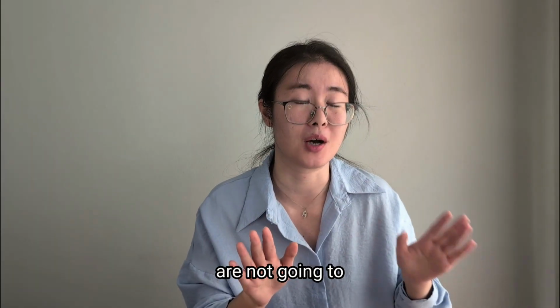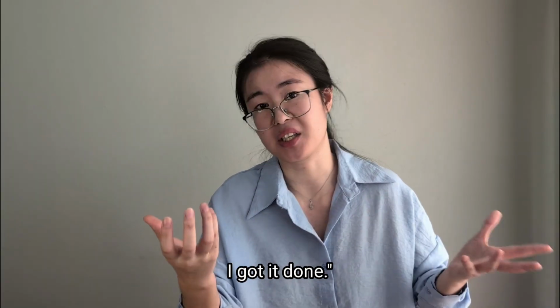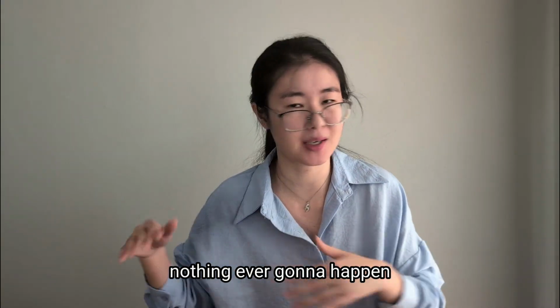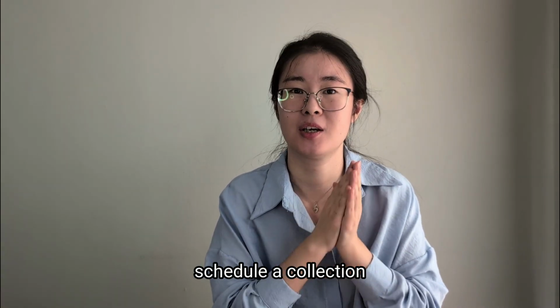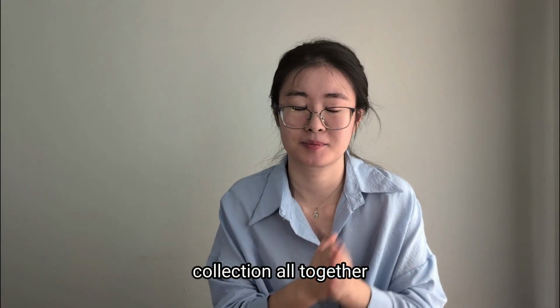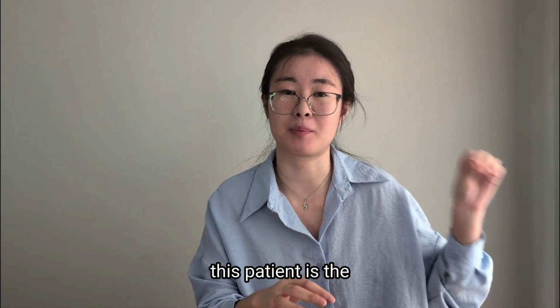They are not going to. They'll be looking at the type and screen you sent to them and then be like, okay, I got it down. If you don't send them a second one, nothing is ever going to happen. They need the second sample if that's a new patient. So if you're going to schedule a collection for a new patient, you schedule the second collection altogether. And they had better be 10 to 30 minutes apart. That way they know this patient is the patient you want to do work on.